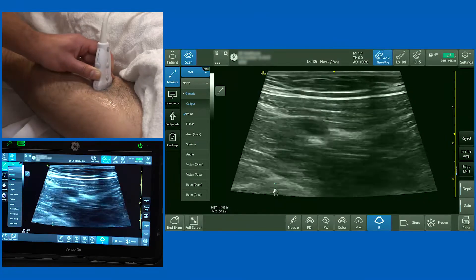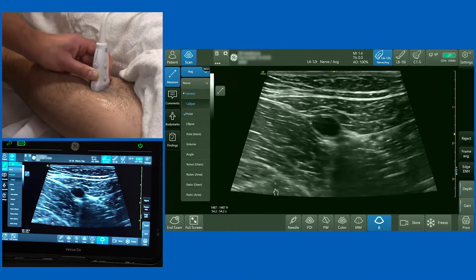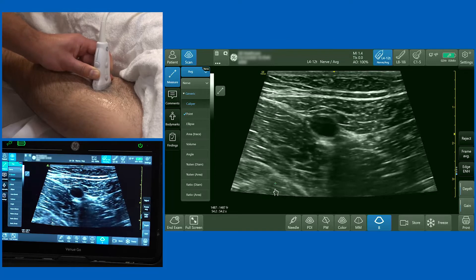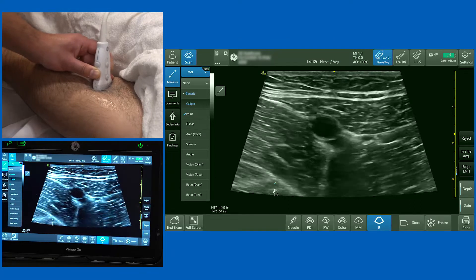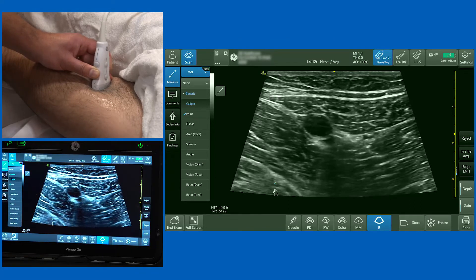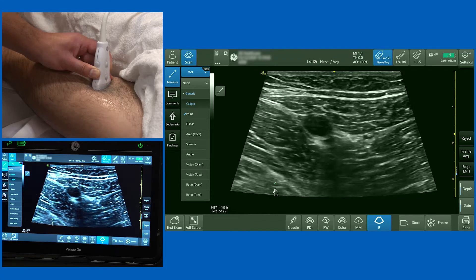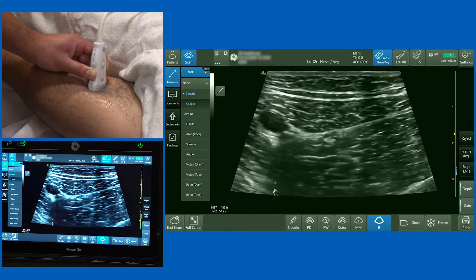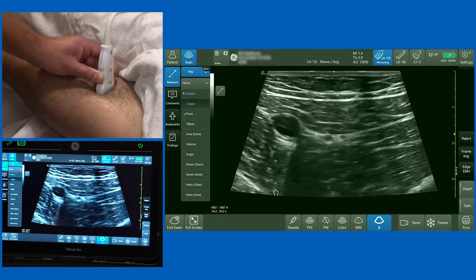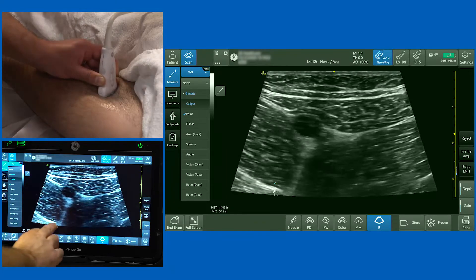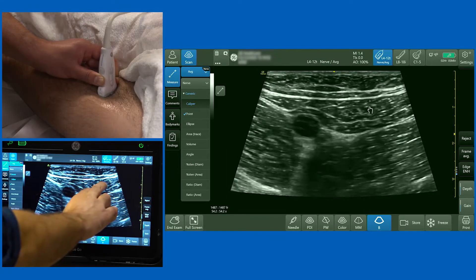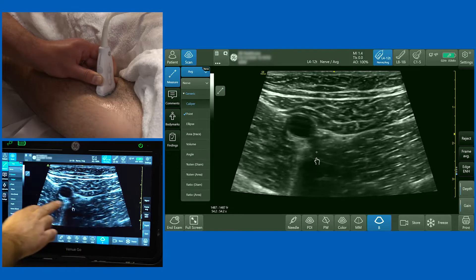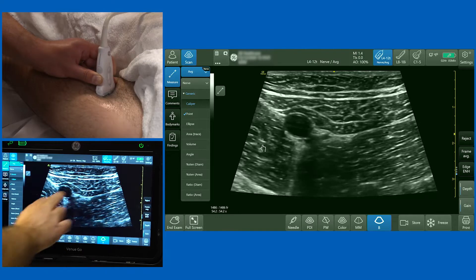In order to optimise your injection point, it's worthwhile identifying the apex of the femoral triangle — that's the true injection point for this block because it ensures that you get the nerve to vastus medialis. If you start high up in the thigh you'll notice the sartorius muscle swings out laterally; this is vastus medialis and this is adductor longus.